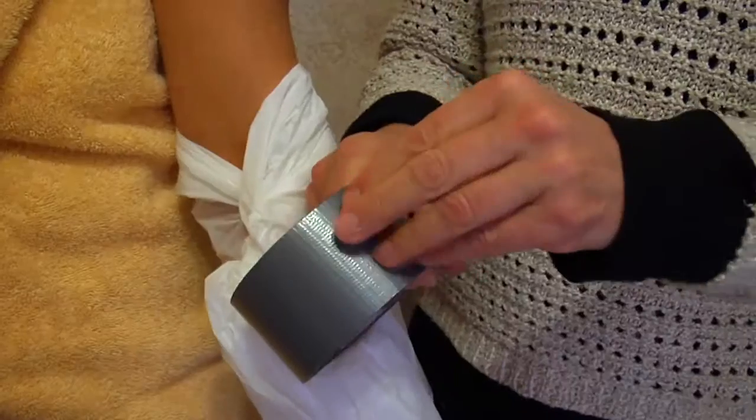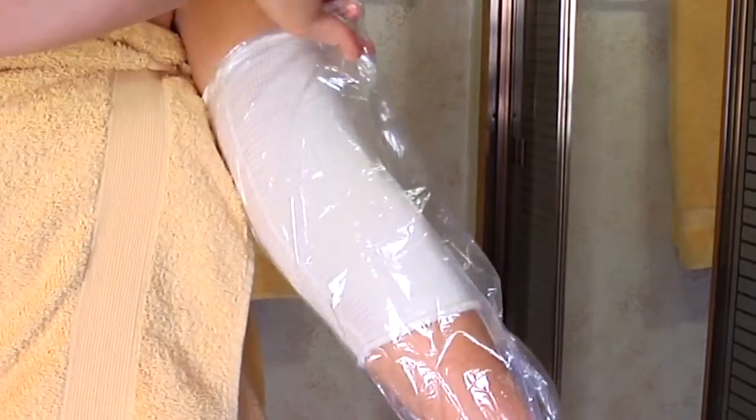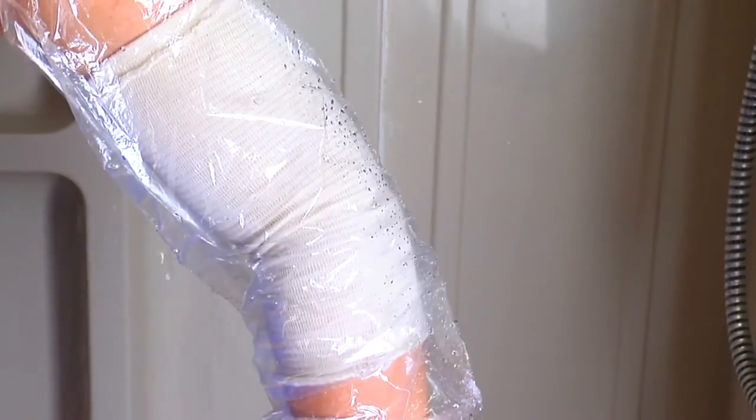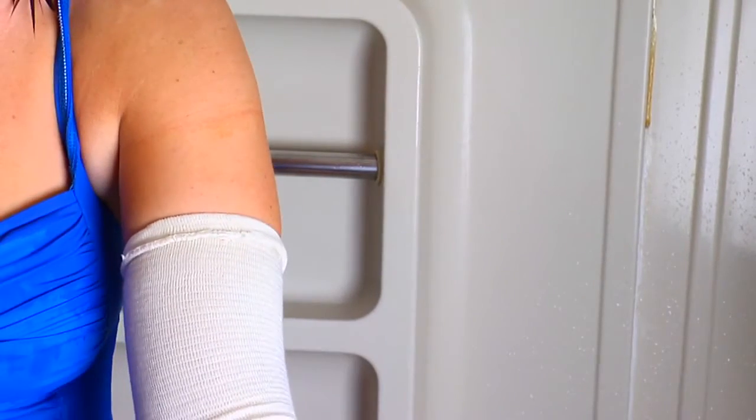Is your facility struggling to keep casts, pick lines, and dialysis ports clean and dry? We're here to help with the introduction of the disposable shower sock. The disposable, easy-to-use protective shower sock keeps injured areas dry and is designed to help prevent infection.